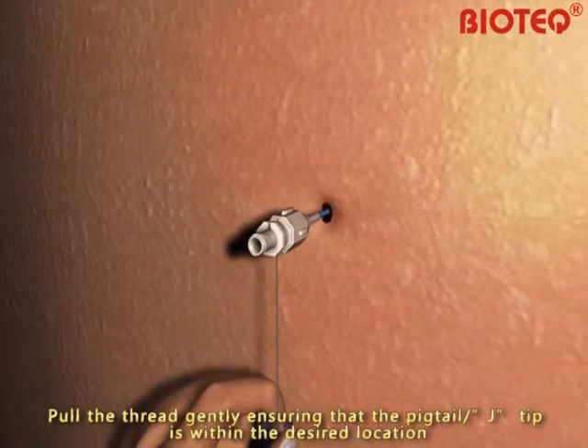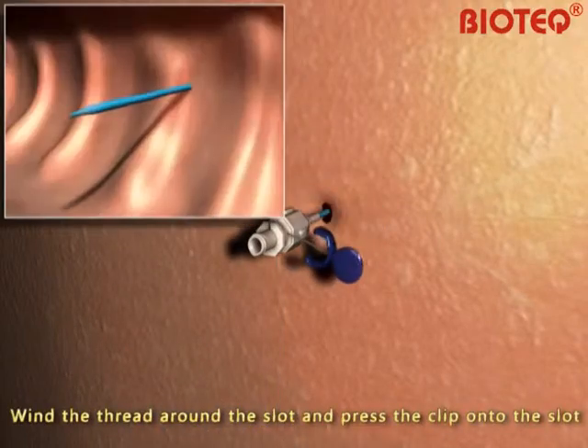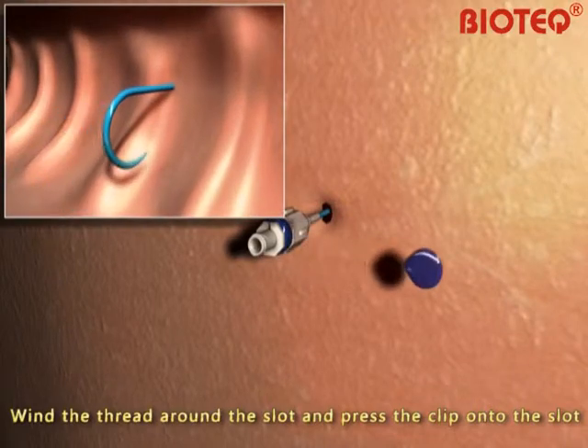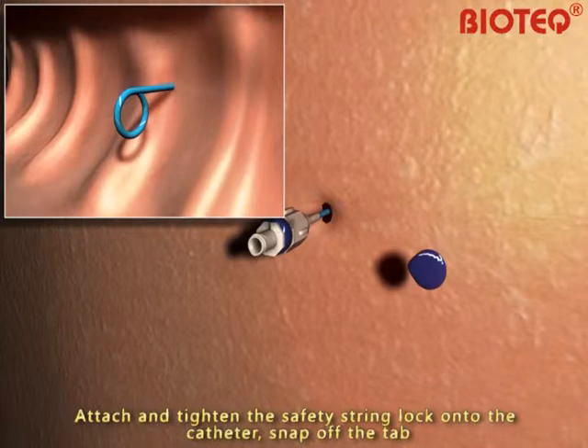To lock the pigtail in its position, pull the thread gently, ensuring that the pigtail tip is within the desired location. Wind the thread around the slot and press the clip onto the slot. The thread must be stretched during the process. Attach and tighten the safety string lock onto the catheter.